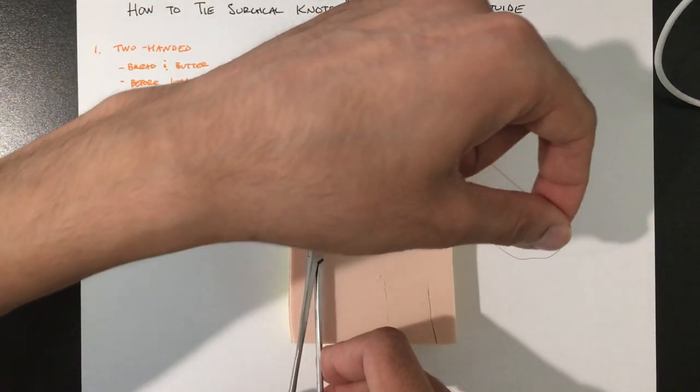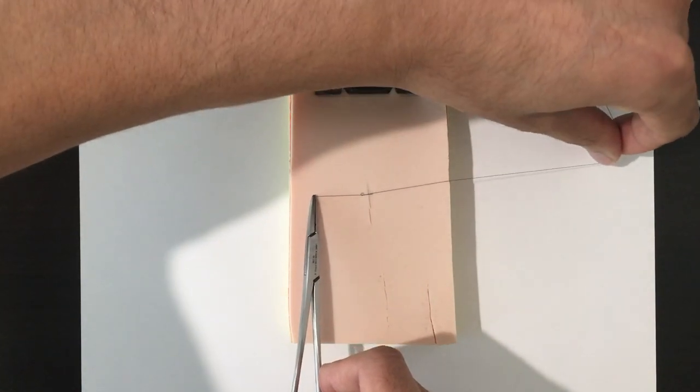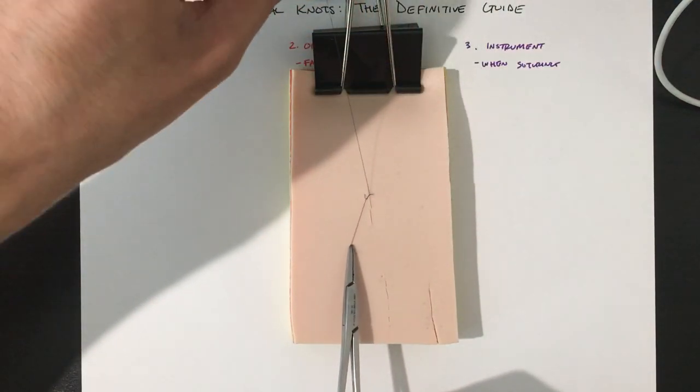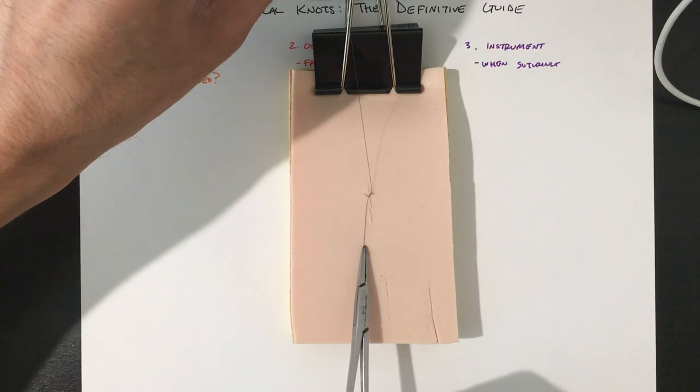Now, a lot of people are going to be pulling opposite direction like this, left and right. I instead recommend you do up and down. This will be a lot more efficient in the OR.